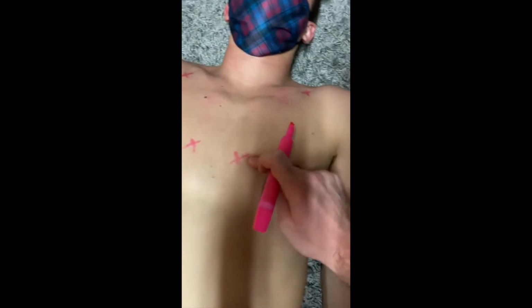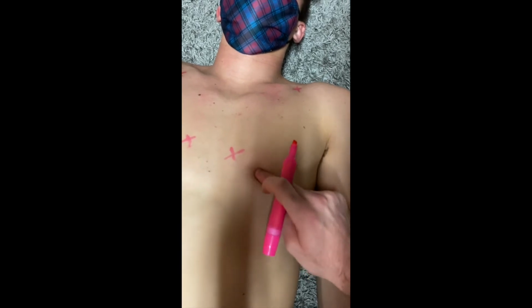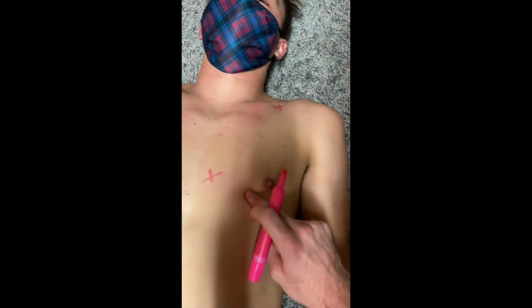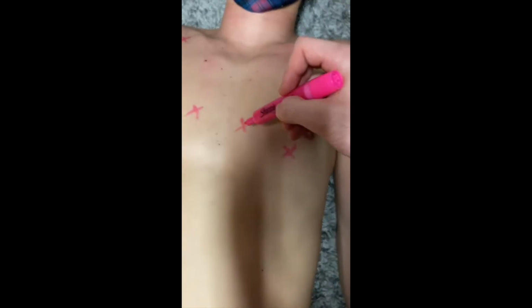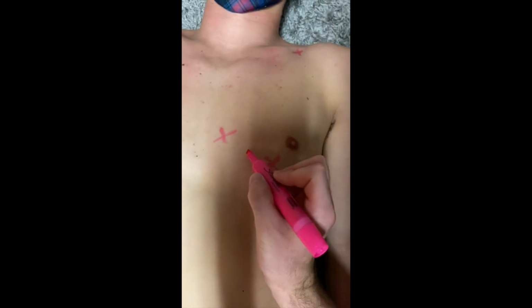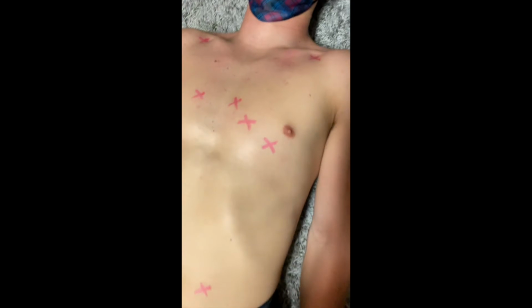we can find the 5th intercostal space. So here's the 4th, you can feel it right here. And here's the 5th. So right about there, I'd say. So that's V4. And then midpoint of a straight line between these two. And there's V3. So now that we have V4 done right there, we are going to start on V5.